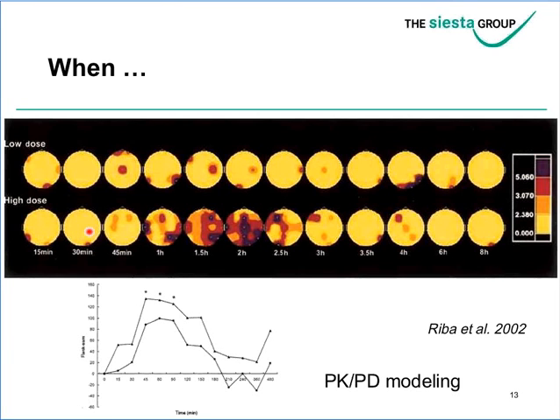At each of the time points, if you represent your activity as a summary topographic map, you can clearly see at what points in time the action reaches its peak.